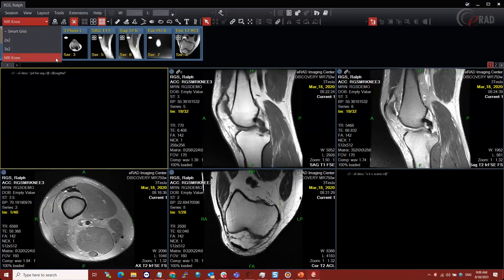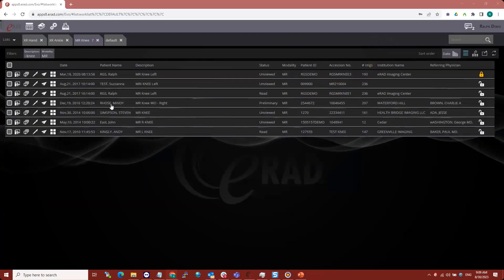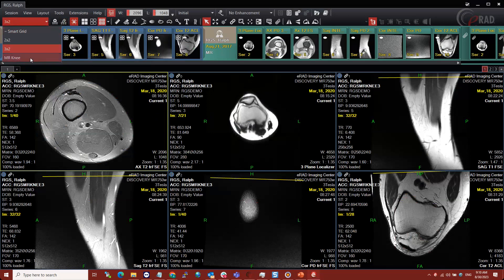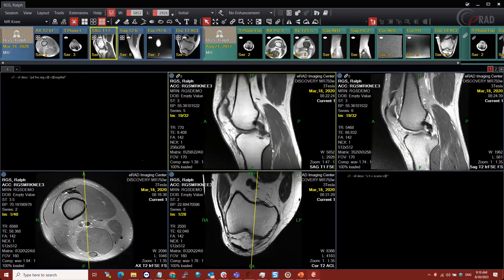When I close and reopen that study, it's also opening with the MR Knee protocol. Not everything will open with this protocol — for example, opening with priors reverts to the 3 by 2 because the number of open studies is another variable the system takes into account. You also have the ability to create a separate hanging protocol for priors if you like. Most people prefer just one hanging protocol.